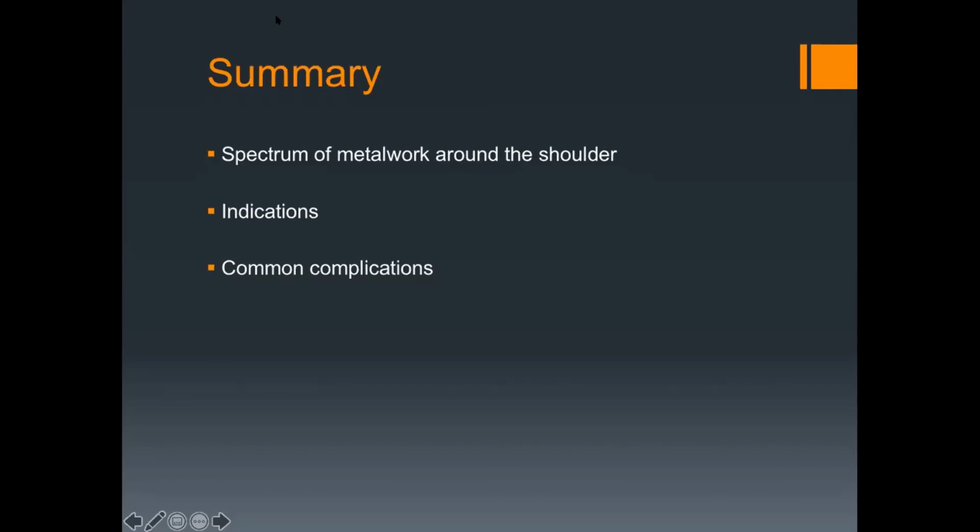And the other thing is with reverse shoulder arthroplasty, we showed the socket getting loose. There was one you showed, Chris, where it looks frankly loose. That's probably an intraoperative problem, or it's infection. If you've got gross loosening of a reverse glenoid now, what we're finding is that the sockets are lasting really well, because it's an uncemented socket that gets concentrically loaded, and I think these sockets are going to last quite a long time.